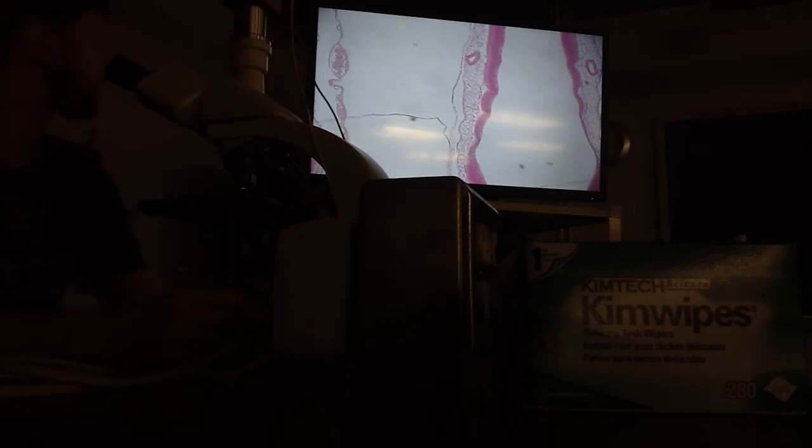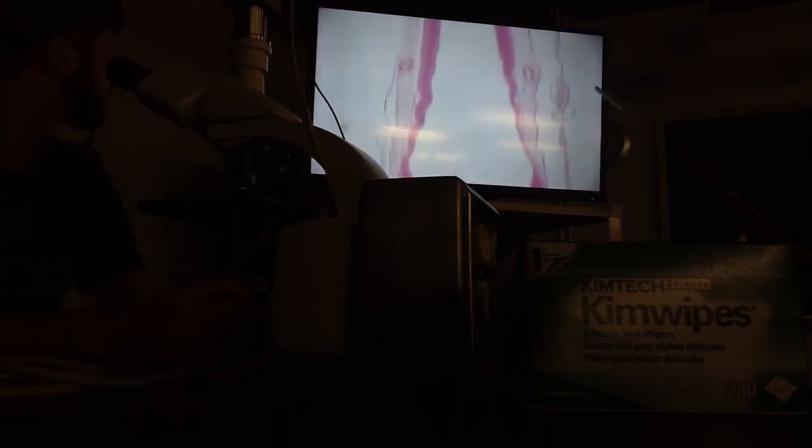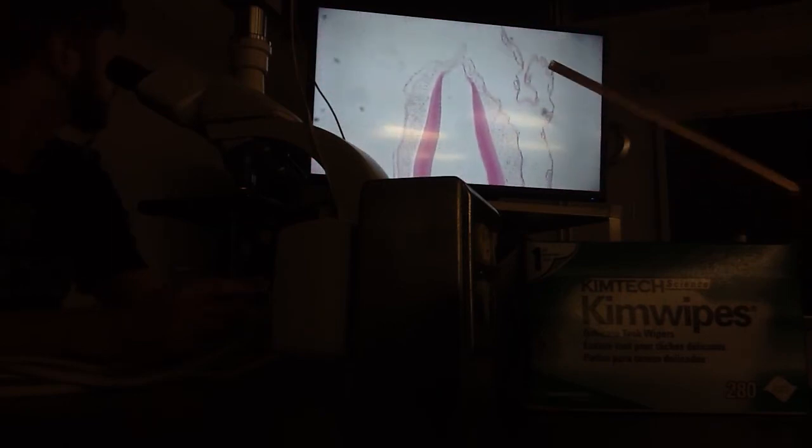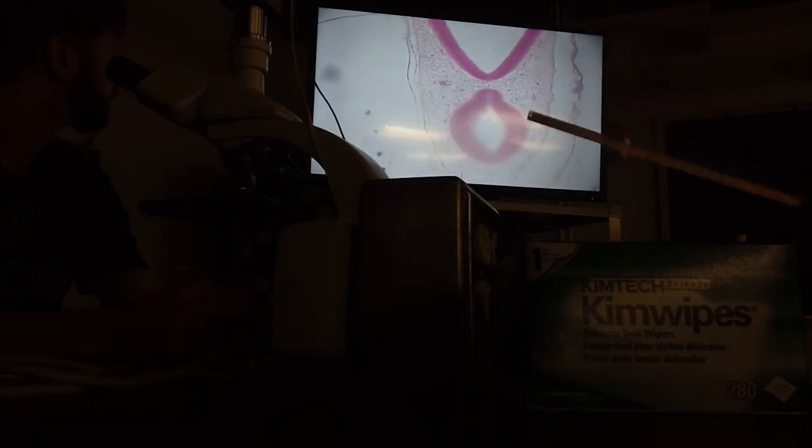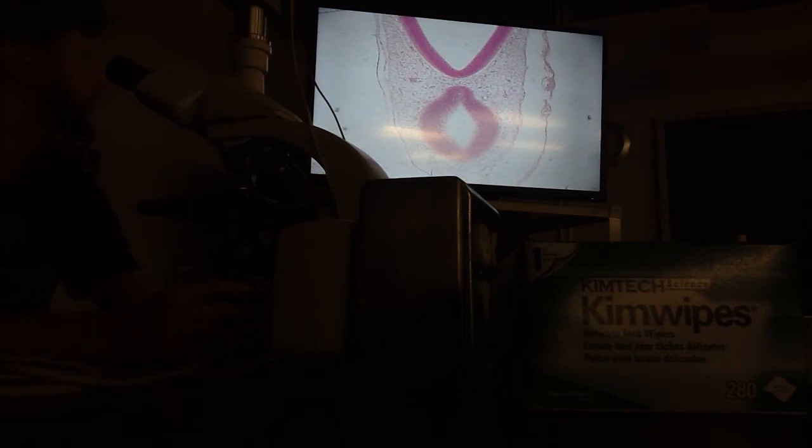All right, stop right there. Go up to this region here. Come down. Come down. There's something, and there's this. Now, I'm going to give you a little quiz. I'm going to point, just as he will on the practical, to 3 or 4 parts of this system. And let's see if you can interpret where we are.